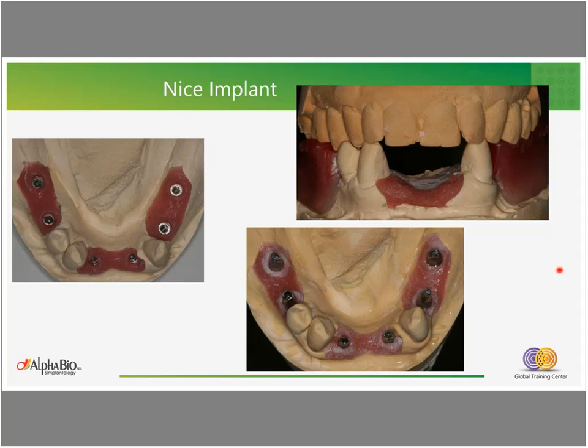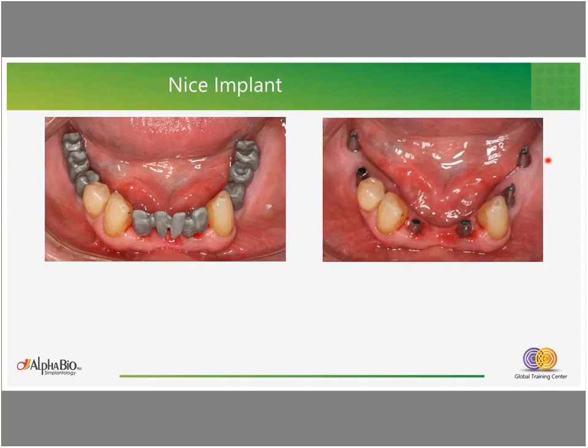After the fabrication of the abutment, we have the metal frame that has to be checked in the mouth, and of course we need to make the registration of the centric relation and intermaxillary height again in order to be sure that we have sufficient clearance for the porcelain building. And this is the final restoration.